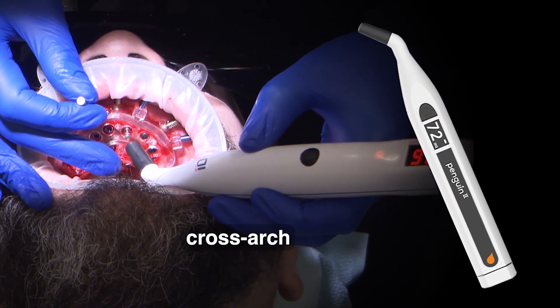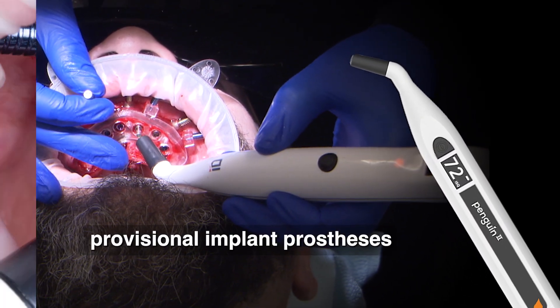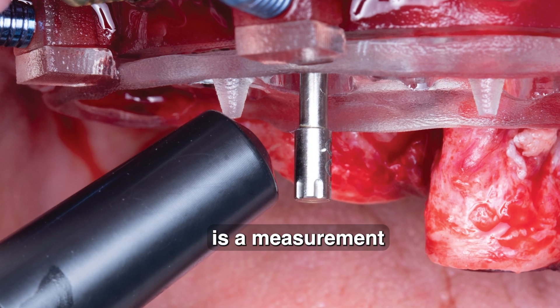The acceptable stability range for cross-arch immediate loading with a provisional implant prosthesis is a measurement somewhere between 55 and 85.